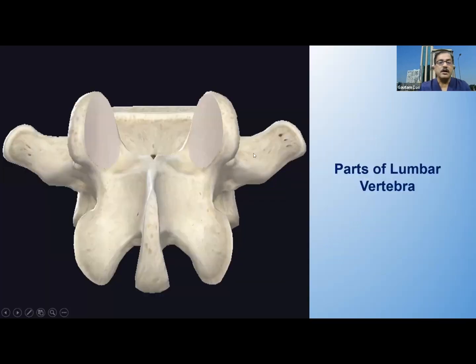So this lateral-most part is your mammillary process. We'll be discussing it when we'll be scanning it. This lateral-most part is the most projected part. If you look at this whole articular process, the lateral process is your mammillary process, and there is another small process here which is called the accessory process. There is a ligament, the mammillary-accessory ligament, which I'll come to, under which the medial branch actually runs. And the other parts, lamina, inferior articular process, spinous process, you all know that.